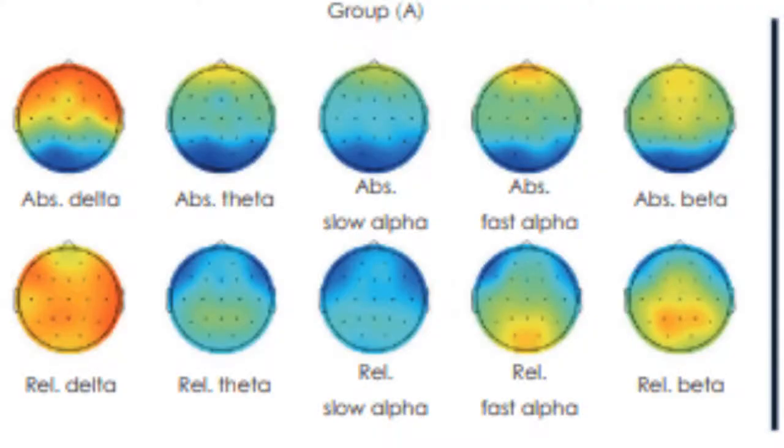But the fact of the matter is we can graphically represent this and put it in picture form. Again, remember that top-down looking formation, where we can see the nose and the ears. For certain waveforms, we can graph where they seem to be more prevalent. And why is this important? Because we can get a big picture of the person as a whole.